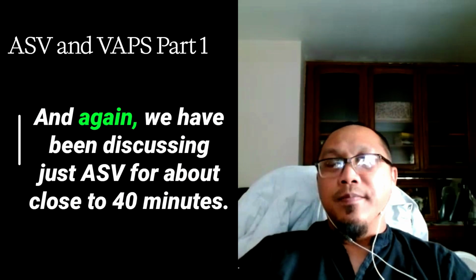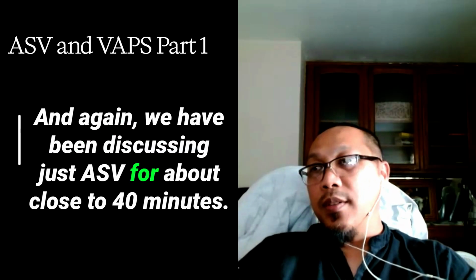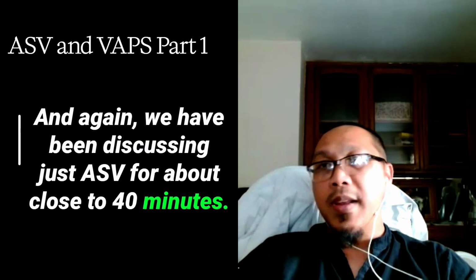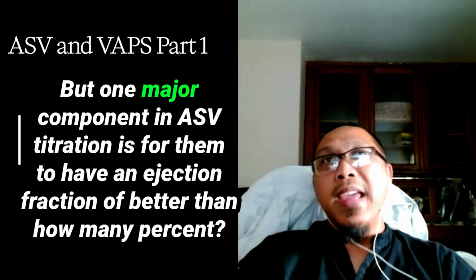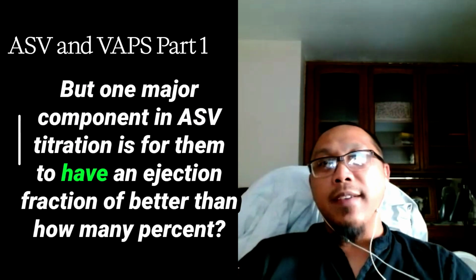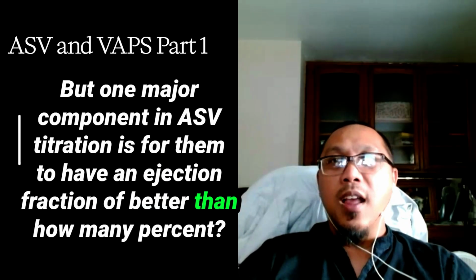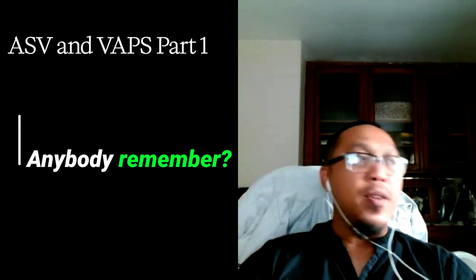And again, we have been discussing just ASV for close to 40 minutes. But one major component in ASV titration is for them to have an ejection fraction of better than how many percent? Anybody remember? 45%. Okay, very good.